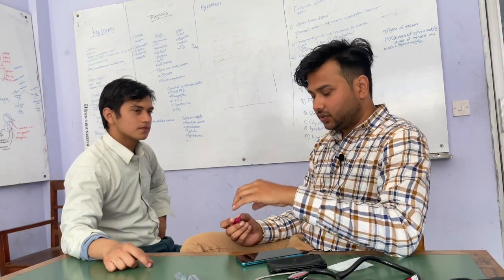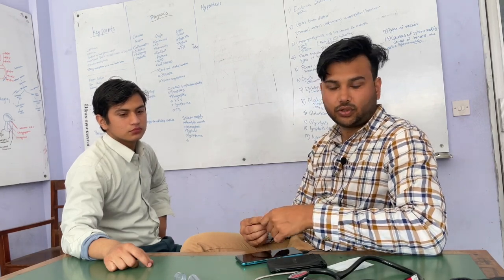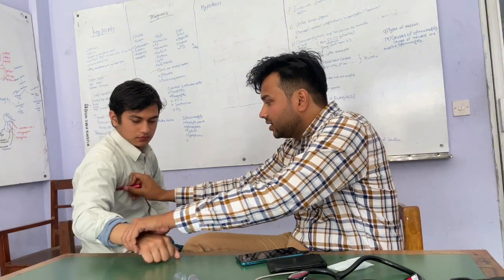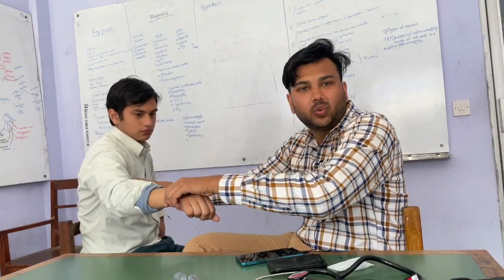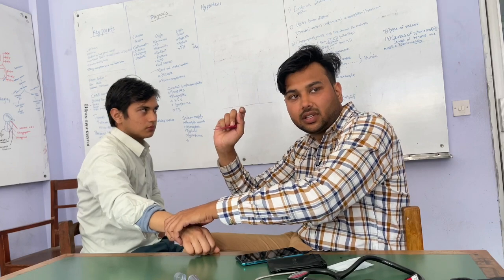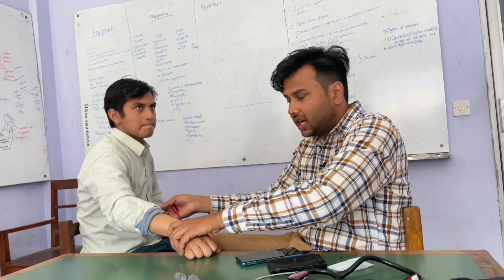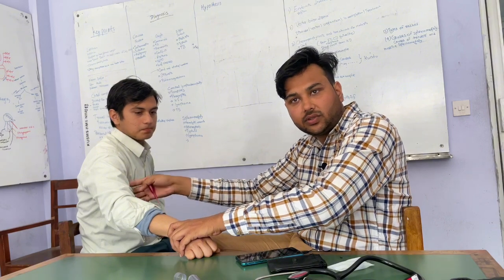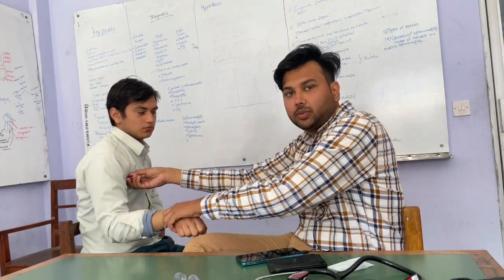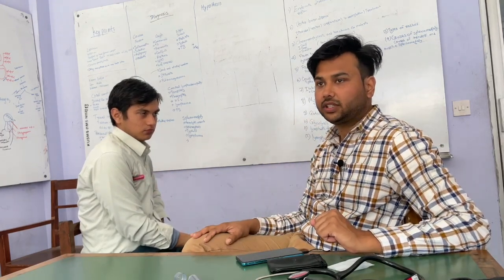Okay. Nowadays there is only the digital thermometer. Previously there used to be a mercury thermometer, so you don't need to worry about that. With the digital thermometer, press it and keep it under the axilla. Make sure the axilla is not wet. If the axilla is wet, or there is lots of hair, there will be a false reading. If the patient has fever and his fever has recently come down, he has sweated a lot and it will be wet. So wipe the wetness using a tissue, right? After that, keep the thermometer and try to adapt it. After 1 minute, it will beep and show you the temperature of this patient.